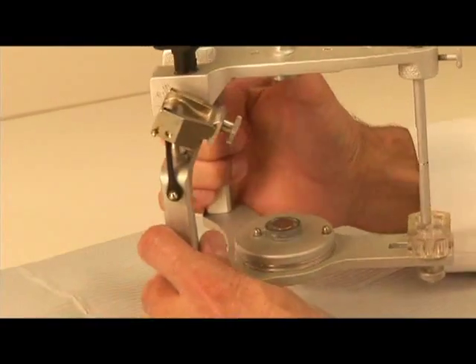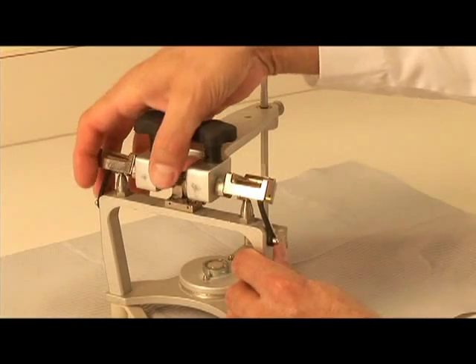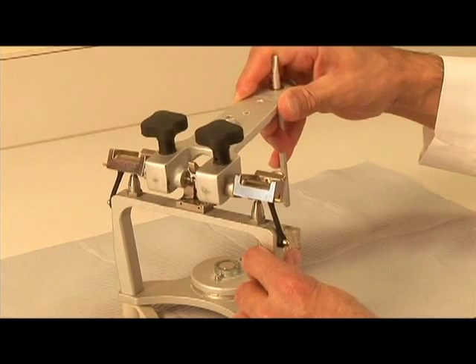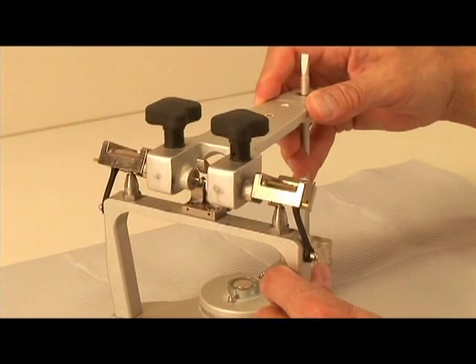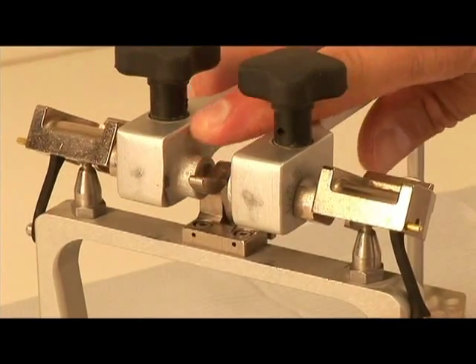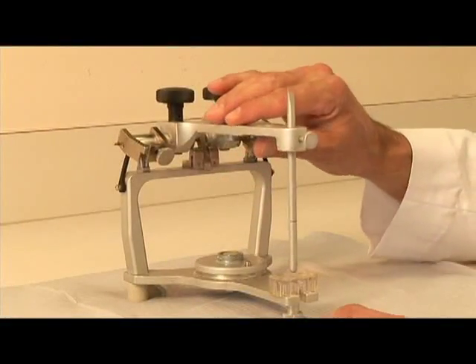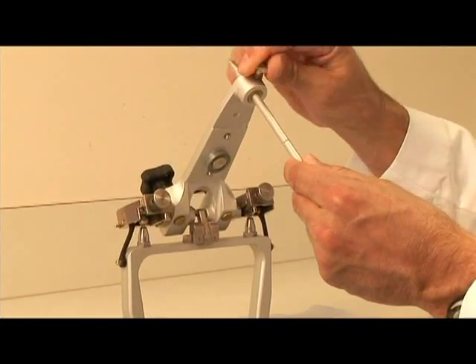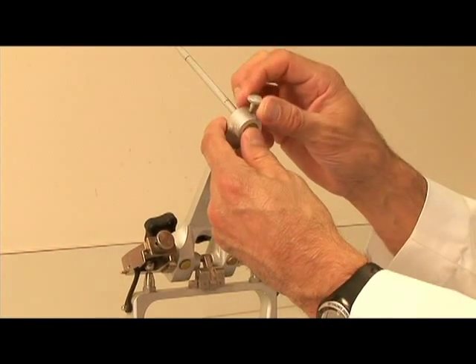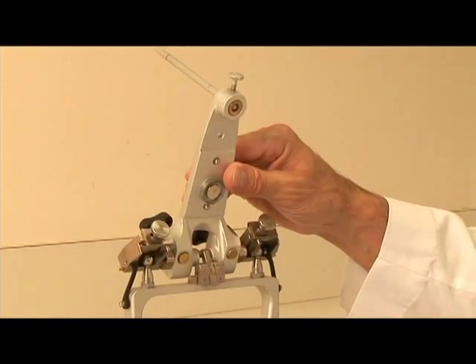The third part of the articulator that needs to be set is the centric lock. During the mounting of the maxillary cast and the mandibular cast in centric relation, the centric lock mechanism should be in the locked position. The articulator is now ready for mounting the face bow. Raise or remove the incisal guide pin so that it won't interfere with the upper member being placed on the crossbar of the face bow during the mounting procedure.